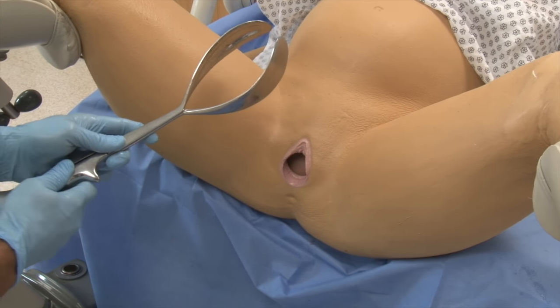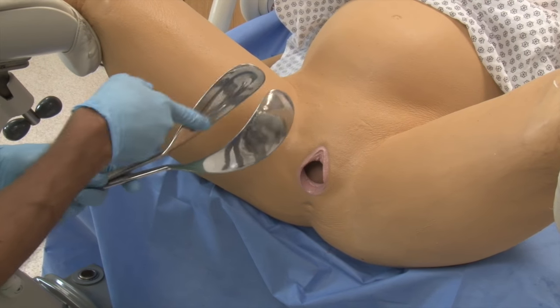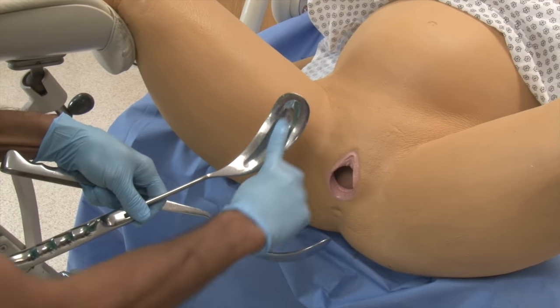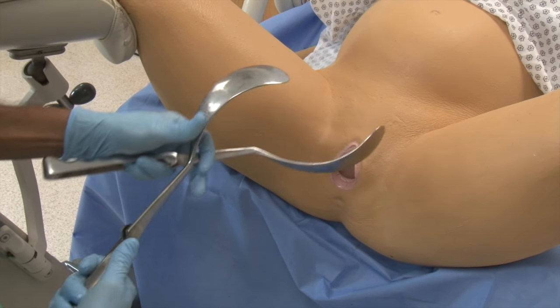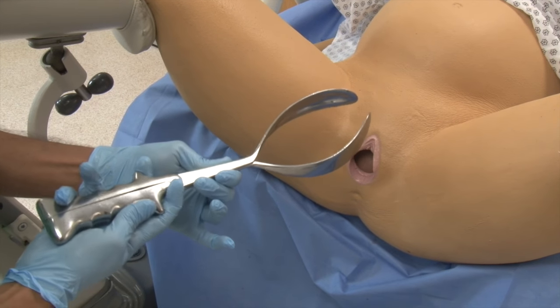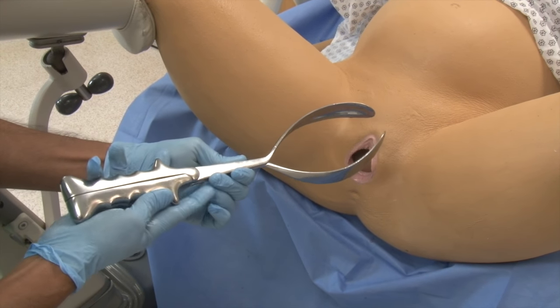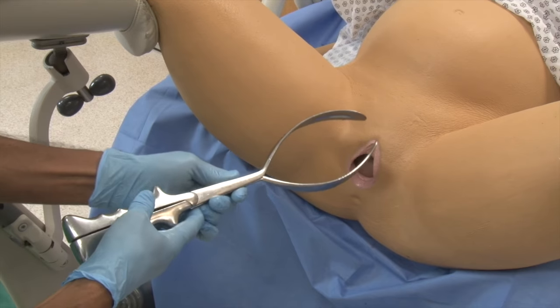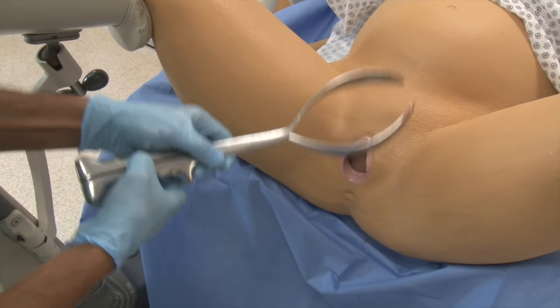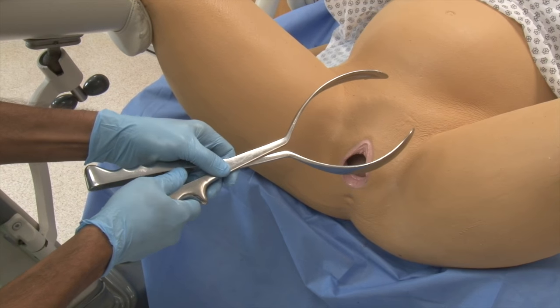We're going to be using Tucker blade forceps with a pseudo fenestration, which shows there is an actual impression on the inside but the outside plates are closed. The first thing we should do when applying forceps is apply it in a phantom way to see which way our blades are going to be. With LOA and occiput on the left side, it's going to be applied in this fashion.